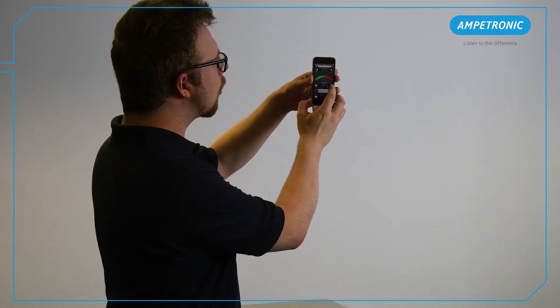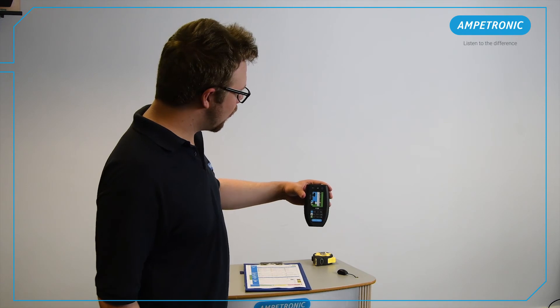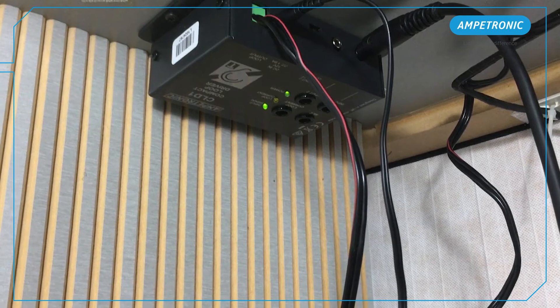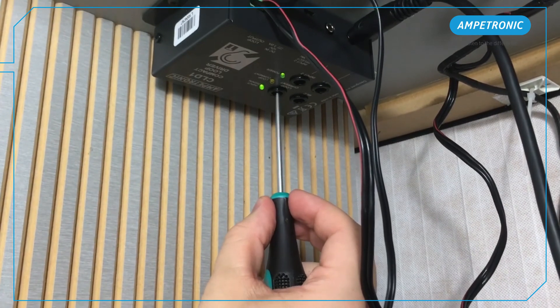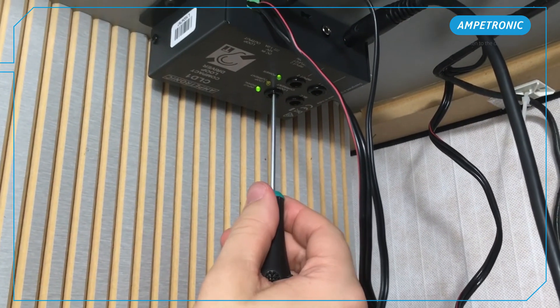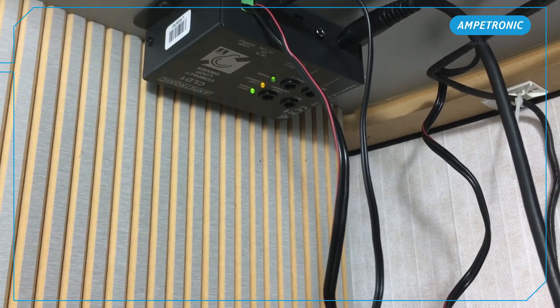You can do a quick check now to make sure everything is working. Speak into the microphone and ensure the green input signal LED lights up. If it doesn't, then try turning up the input one level slightly. You should now also see the orange LED starts flashing. If not, then try turning up the loop current control. At this point, a hearing aid user or someone with a basic loop receiver stood in front of the counter should be able to hear your voice through the loop.